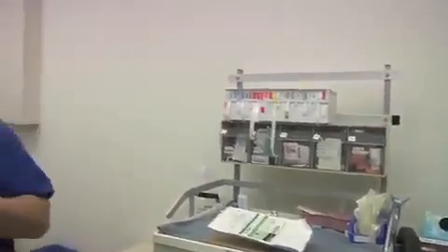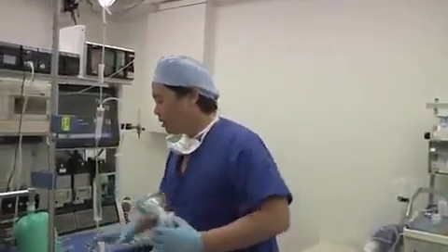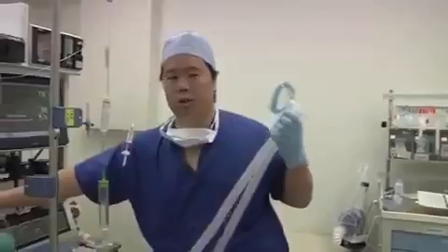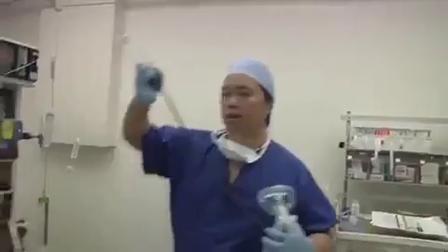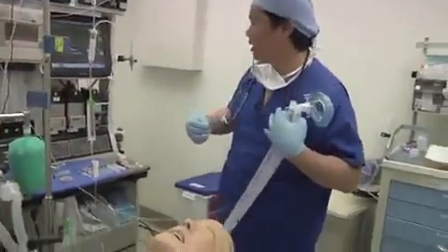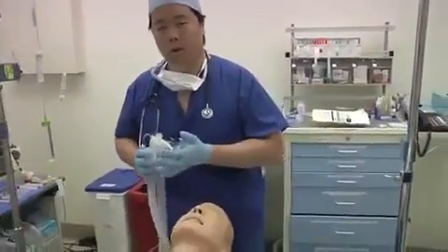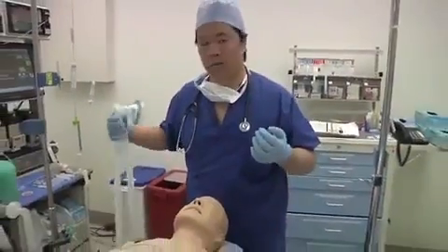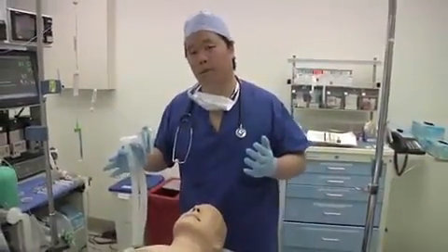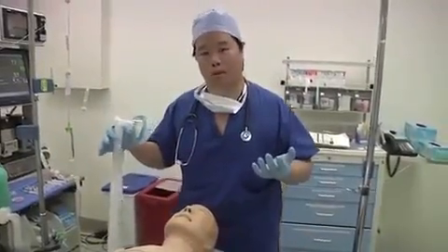So once you have all of these elements in place, now we're ready to go ahead and begin preparing for induction of anesthesia. The first step is to make sure that you adequately pre-oxygenate the patient. I'm also going to, at this point, take my stethoscope and place it here around my neck. So for pre-oxygenation, you want to first explain to the patient what's going to happen. Now, induction of anesthesia can be a very anxiety-provoking experience for many patients, so it's important to be communicative and let them know what's going to be happening every step along the way.